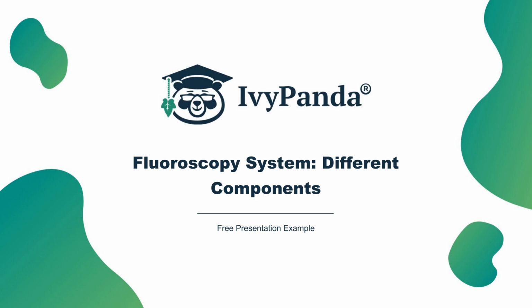Image display. The final step of the fluoroscopy process is an image display. There are several types of monitors. The oldest one is a television monitor. However, since modern fluoroscopy requires high-quality image and video displays, LCD and plasma monitors are widely used nowadays. After the image is projected to the monitor, a recording system may be used to record the video.